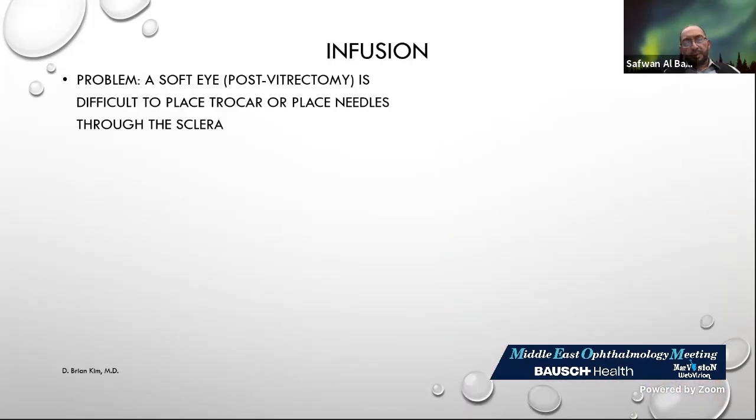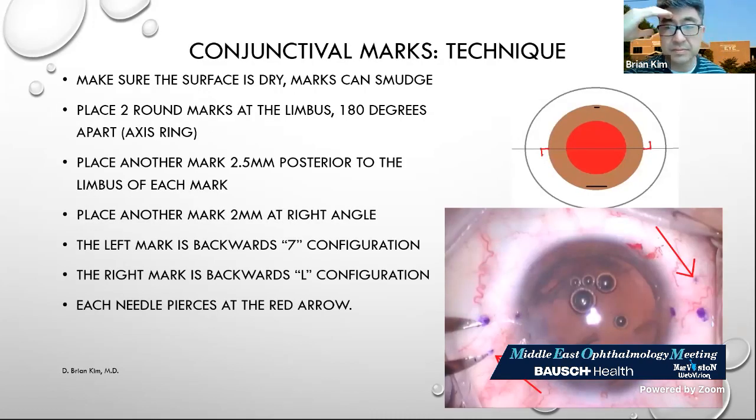Brian, just one point to comment here is that you made 2 paracentesis. Just for the audience, the original Yamane technique uses 1 paracentesis. Your modification is to create another paracentesis at 6 o'clock, and that's one of the important points. I'm using it, so I know, but the other audience members, for example beginners, don't know that the second paracentesis is your modification.